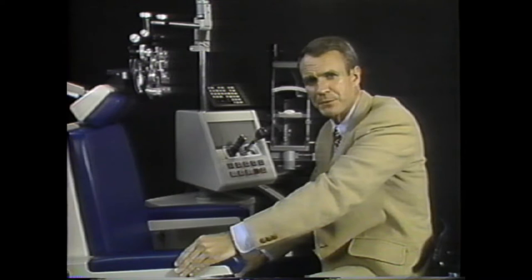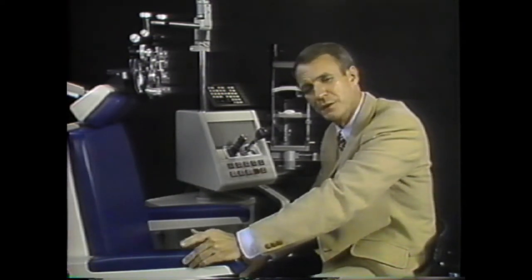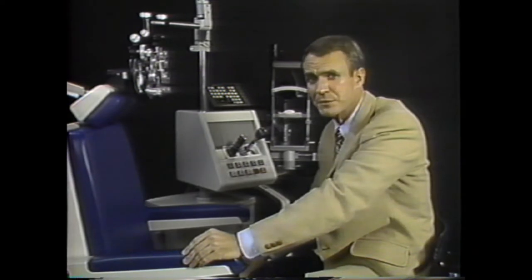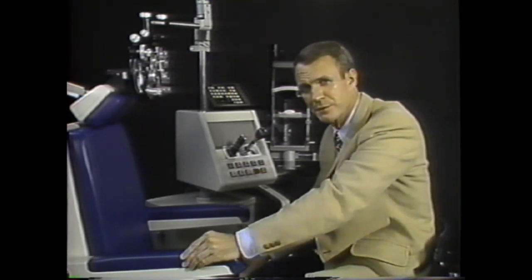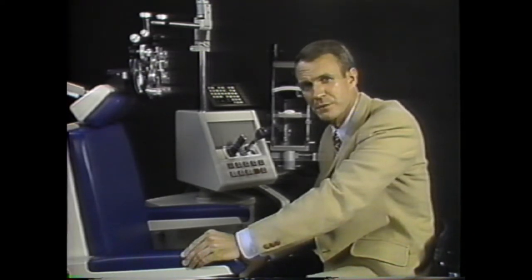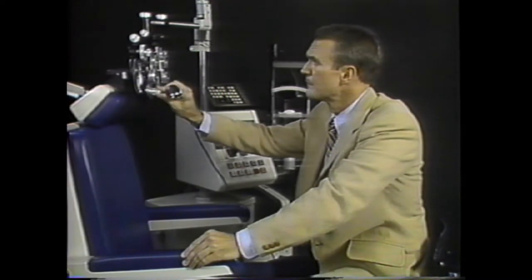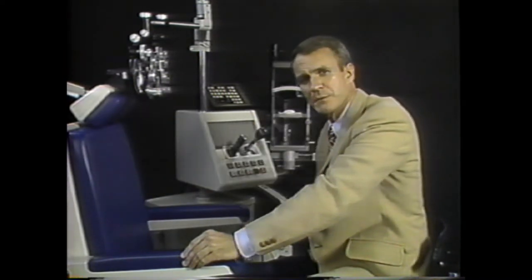Many retinoscopists stop at this point and proceed to subjective refinement of the refraction. It's good practice, though, to refine the cylinder axis and power retinoscopically first, for such refinement is easy and fast with the streak retinoscope. Let's leave a little axis error and power error so we can demonstrate these refinement steps more easily.